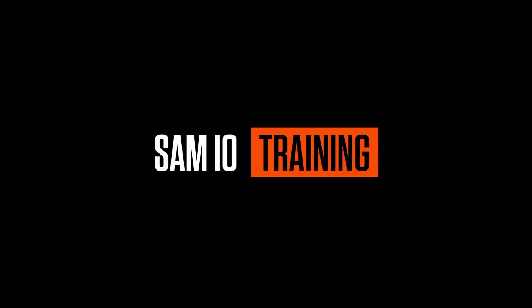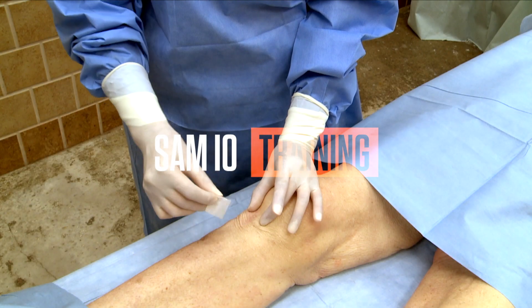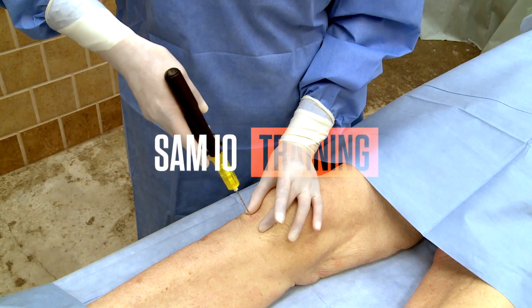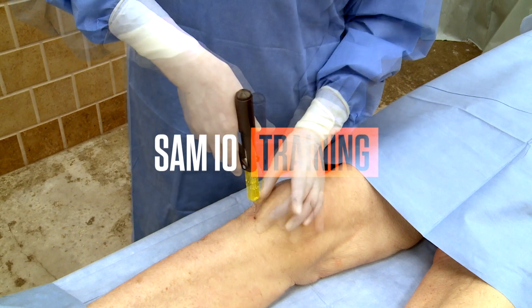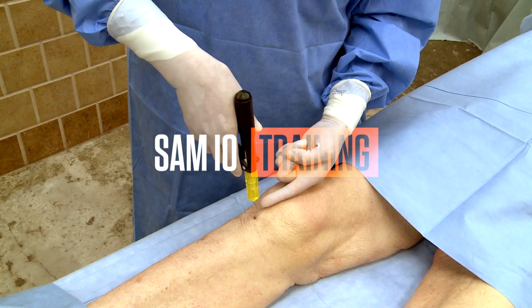The following program was created specifically for SAM Medical and the SAM-IO Interosseous Access System orientation and training. Successful SAM-IO access, as with all medical devices, is predicated on quality education and training. This includes a comprehensive clinical understanding as well as hands-on skills practiced.